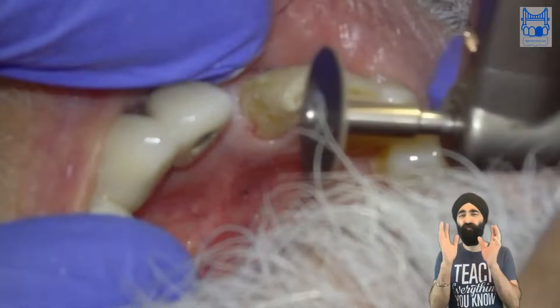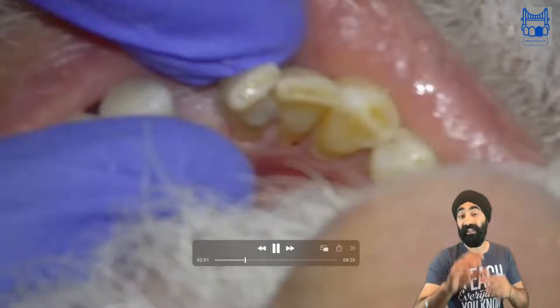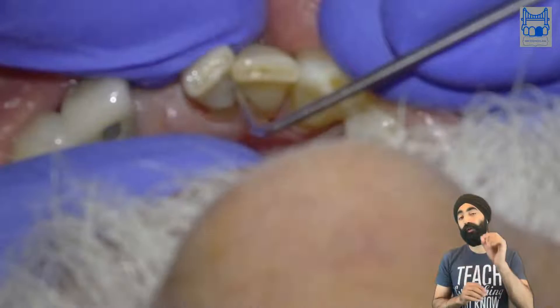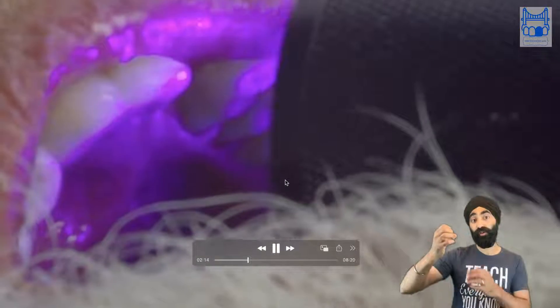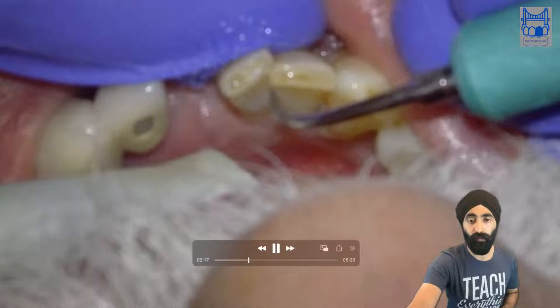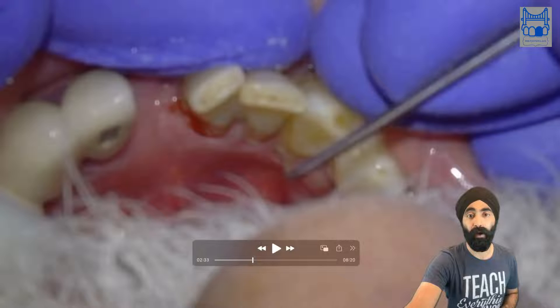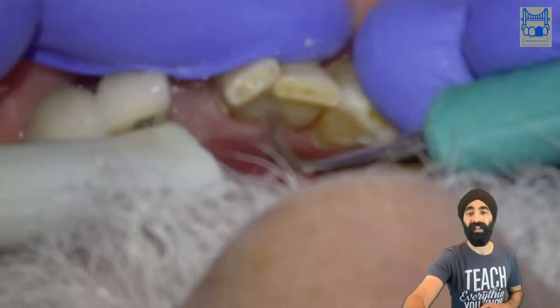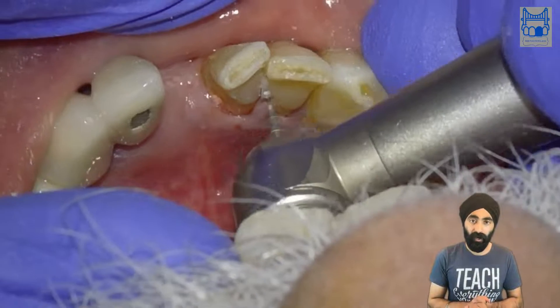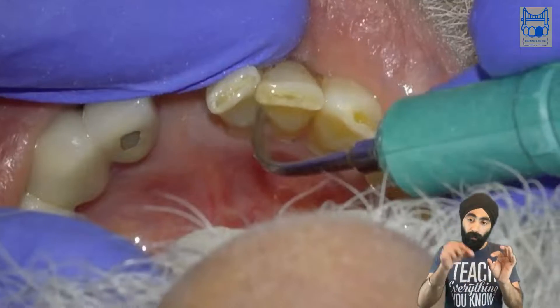I use a Softlex disc to get really, really nice and smooth. One thing you'll see now is a bit of cement I missed in between the teeth in the embrasure — right there. I get a thin IPR burr to remove this cement. You can see it goes bright purple — that's fluorescing in that area. I air abrade which helps me to see, then I use my thin needle-shaped IPR burr. I managed to get it out — got a little bit lucky. Otherwise you'll be there for ages trying to remove it.